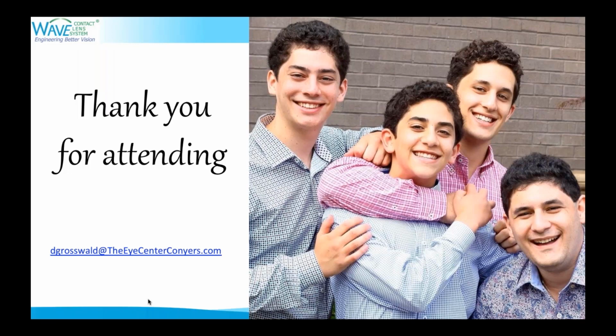I do fit sometimes a ScanFit Pro lens, and because there are more meridians, of course, that's why the lenses are more expensive, because there's more lathe work being done, that sometimes I will have to go to another design when it's a very large pinguecula. I've been fitting the WAVE lenses with pingueculas for quite a while. There's quite, just vaulting it, a larger diameter lens, so it's very, very achievable. But if it's a very large pinguecula, jumping into some of the other technologies has been beneficial. I had a talk with Jim, and there are changes coming that might just address that in the future, but I won't speak to that. I can't be sure of that.